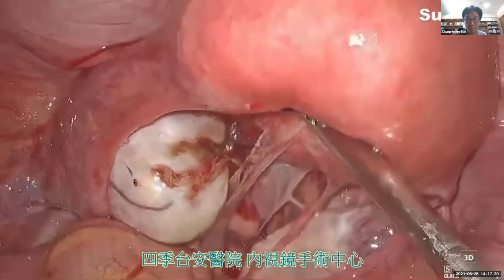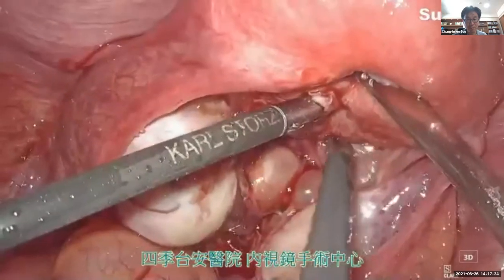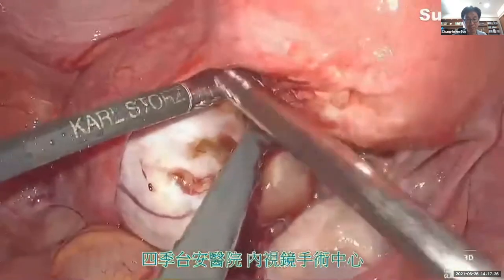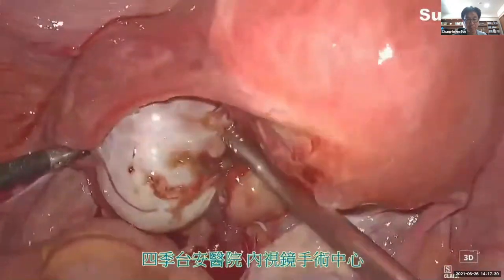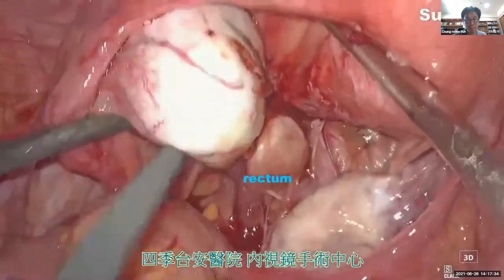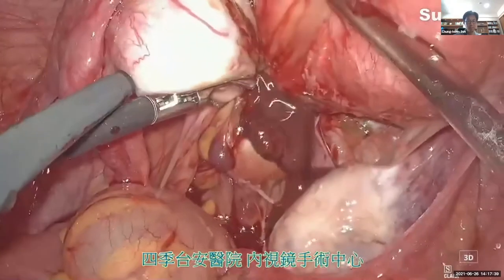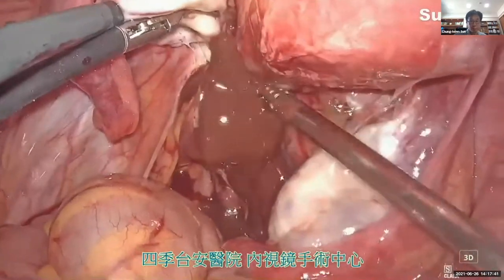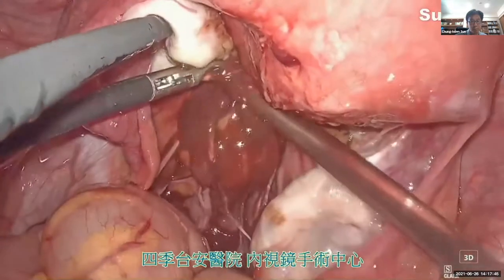Okay, we can see there are some filmy adhesion bands behind the uterus. The uterus has some adenomyosis appearance. We have a left ovarian chocolate cyst, and as we can see, the rectum is stuck on the retro surface. The ovary is also stuck on the uterosacral ligament and the retro surface area.